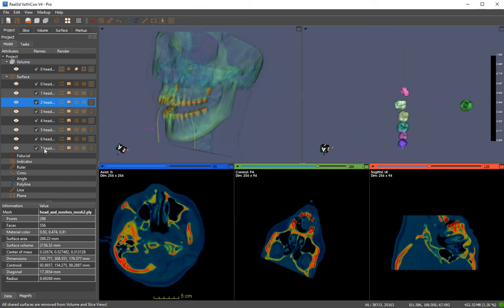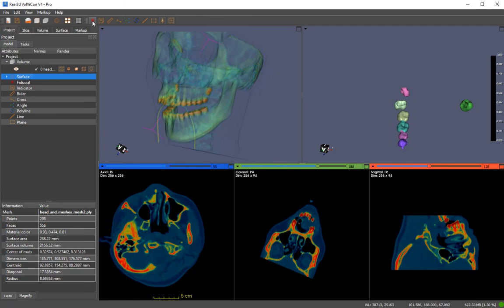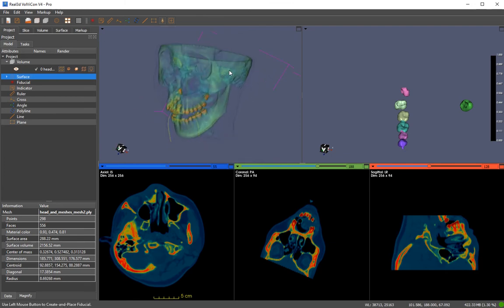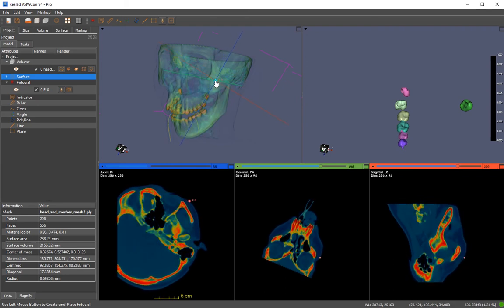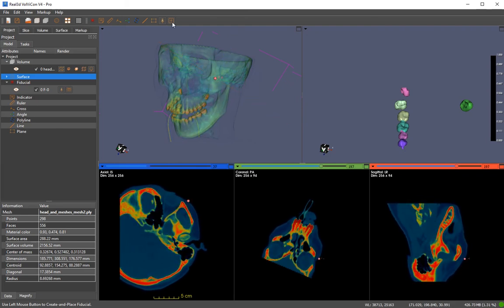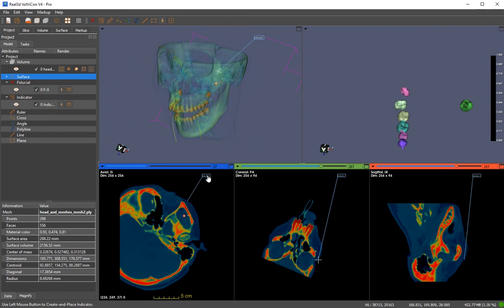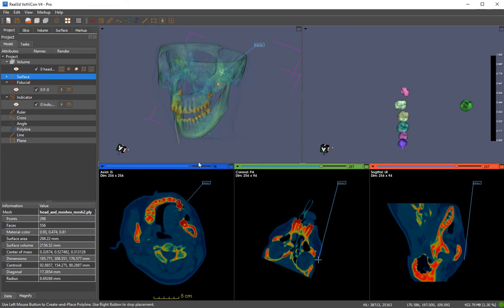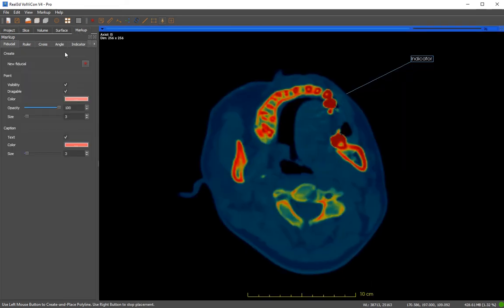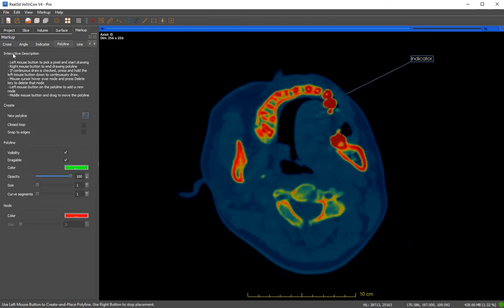Now let me introduce markups. You can create different landmarks. While moving a landmark the slice center is updated — you can disable that so it won't update. You can render these markups in all views. You can have an indicator and track it in all views. Now let me create a polyline. You can set different features for each markup in the markup module.